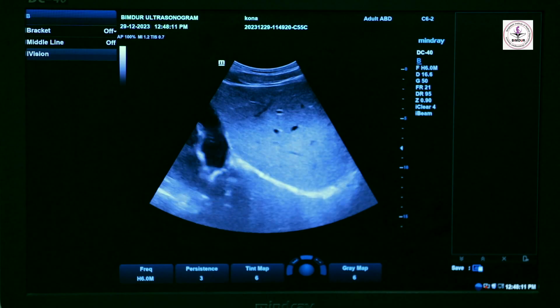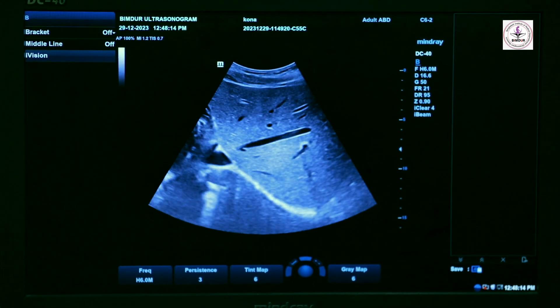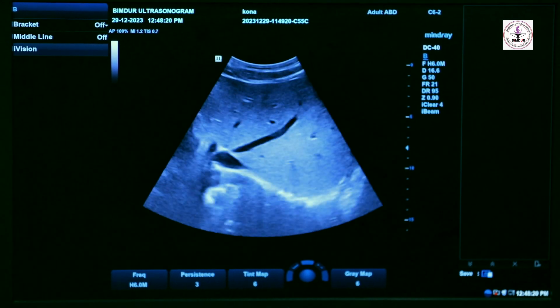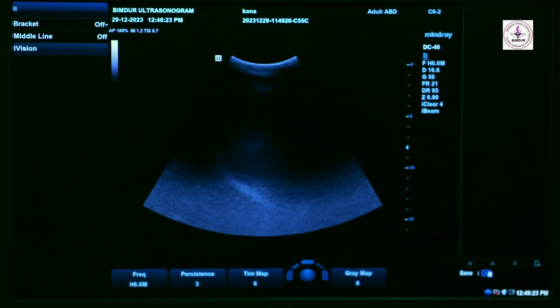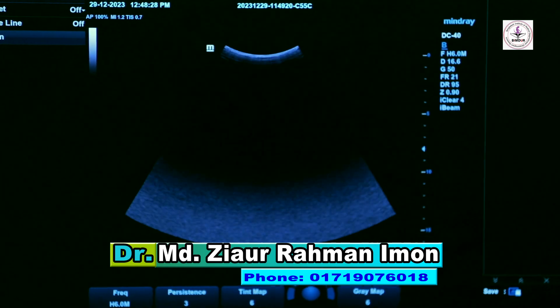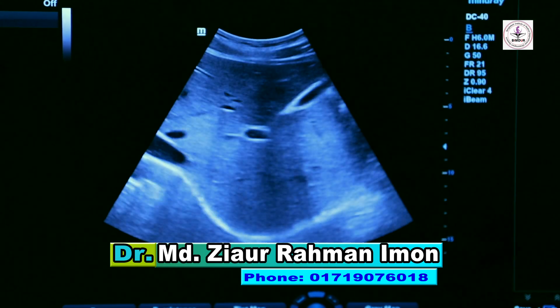Now we see on the screen how to visualize the gallbladder. First we search the gallbladder, then we see the gallbladder on screen, and at that time we can measure it. Let's see the gallbladder now — we search and identify it.